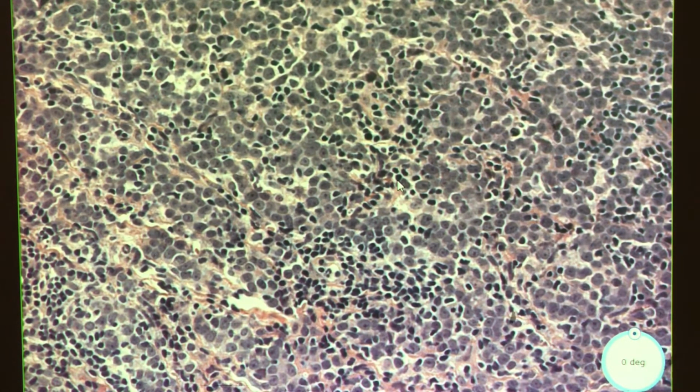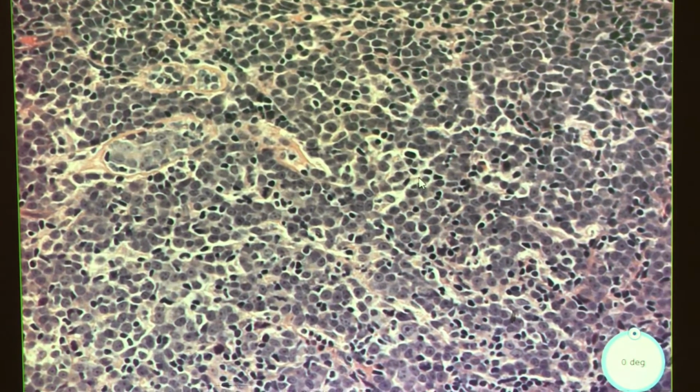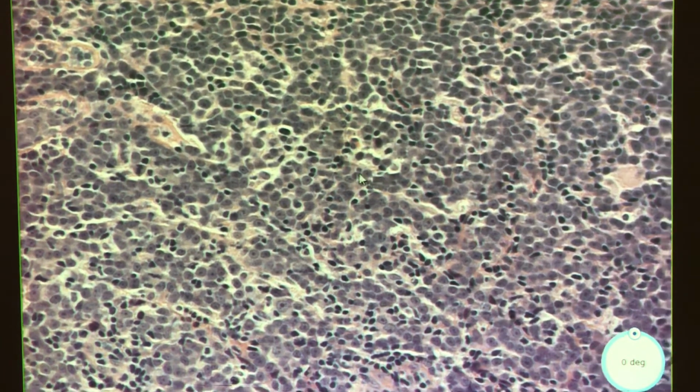We've seen other cells and other lesions that are much bigger, but lymphomas mean they're lymphocytes, they're lymphocytic, and these are so massive. Like you could probably put 4 or 5, maybe even 6 lymphocytes in one of these. So if that isn't enough to convince you of DLBCL, it's a sea of them. Now, maybe you could argue, hey Kara, what if this is a poorly differentiated carcinoma? I think that's a fair thing to say.